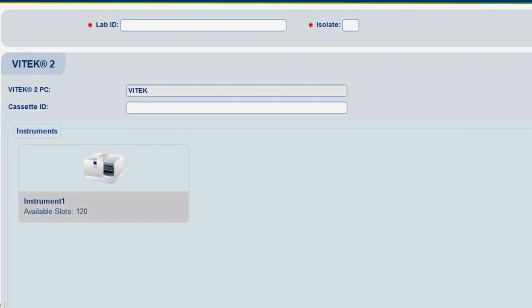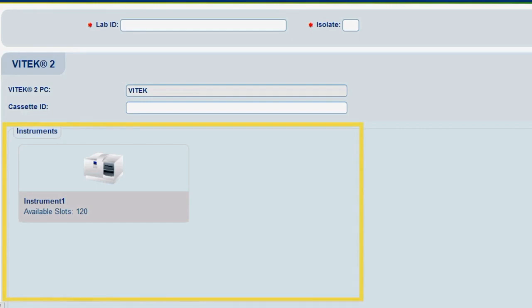Cassettes created must be loaded into an instrument connected to the selected Vitec 2 PC. The Instruments pane displays what instruments are connected to the Vitec 2 PC. In this video, one instrument is connected.